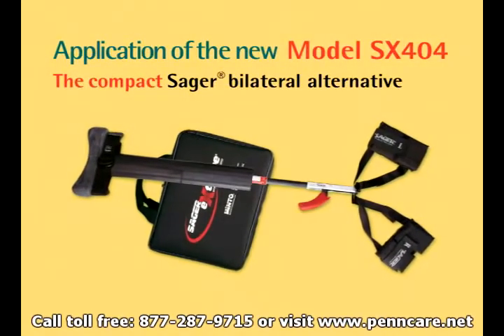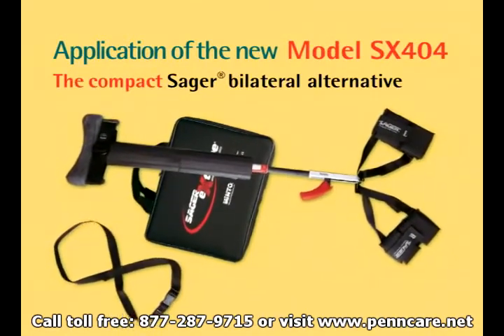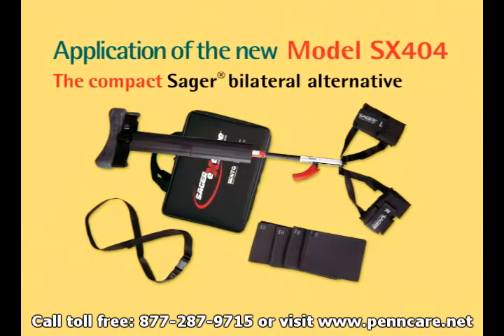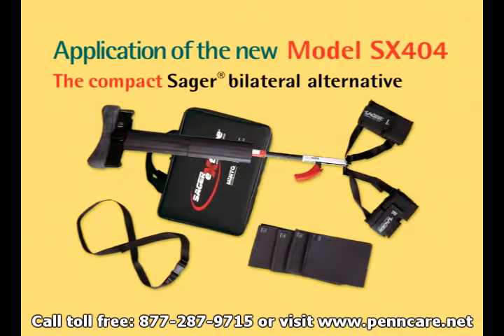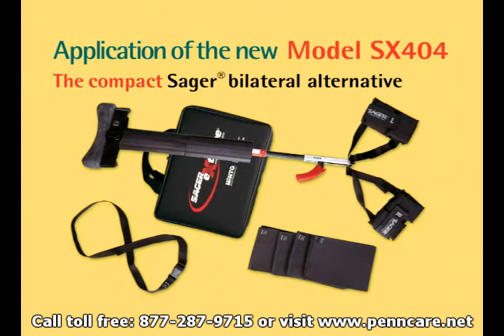Model SX404 has been designed for rapid, one-person assembly and application. The splint can be assembled and applied in under two and a half minutes. To assemble the splint, simply unfold and secure into place. The splint's unique semi-attached design ensures that no major parts will be lost or incorrectly assembled.